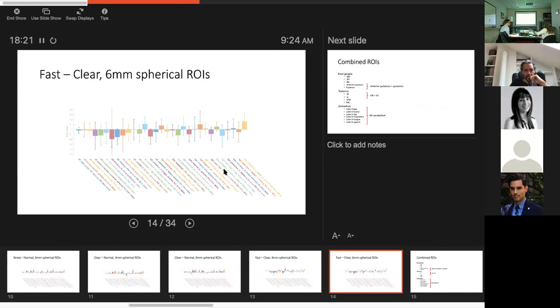So I don't know if just looking at these, I know it's a pretty brief look, but if you have any thoughts on 4 versus 6, or is it very structure dependent? Something like the putamen or the whole thalamus or caudate, 6 is going to be a fairly small piece, right?